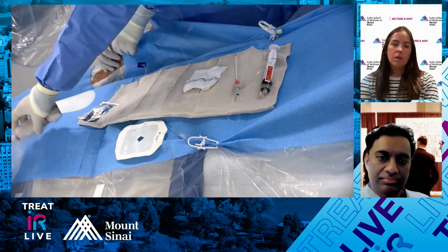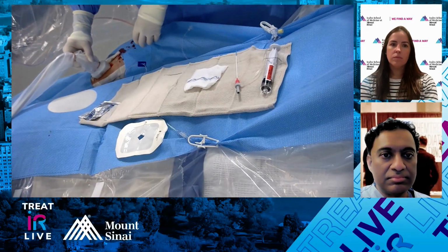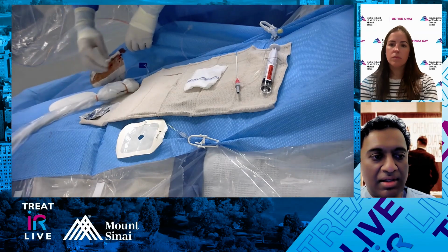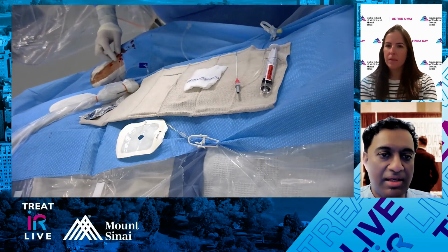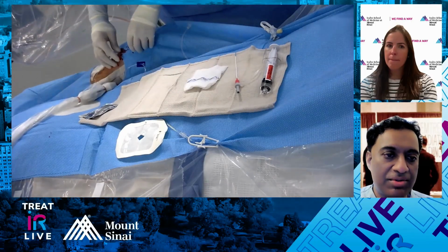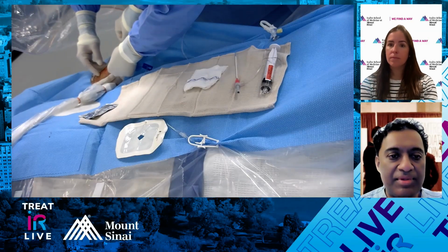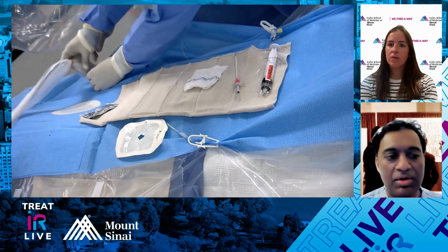His sac has now grown to 8 centimeters. So I think we have to bite the bullet and extend him. I have a low threshold to do this, right? To take out the hypo and extend makes a lot of sense. The other thing you could do is sometimes we'll put an IBE, iliac branch excluder, and Cook just came out with one as well. That enables you to preserve the hypo depending on the ipsilateral limb. So there are ways to do that approach from combo radial brachial.